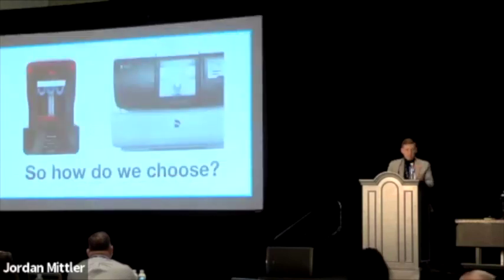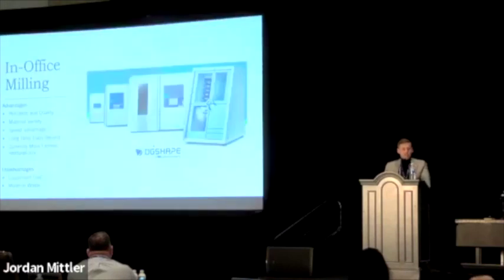So at this point in time, how do we choose, right? There's certainly benefits to milling, right? There's precision, quality, variety. I have an asterisk next to speed advantage because printing is getting very fast. Different printers are updating their software and giving add-on build platforms that are enabling you to get restorations done quickly.